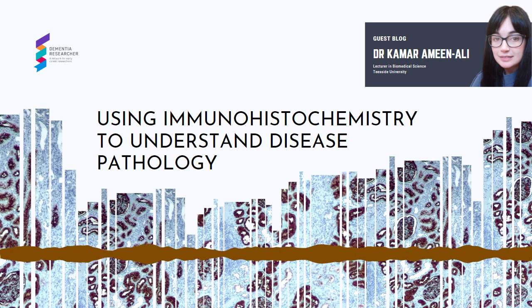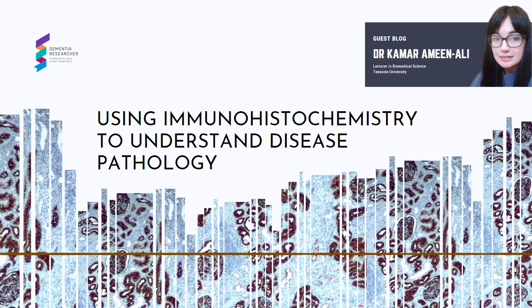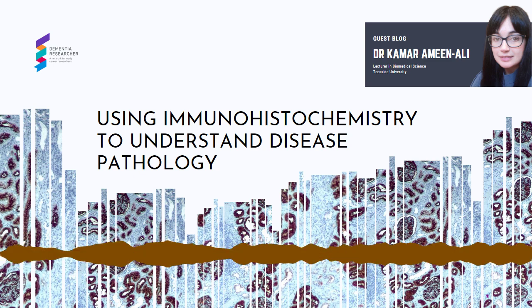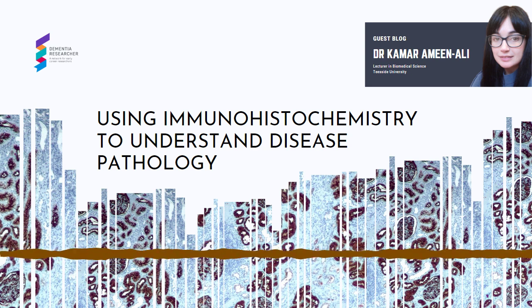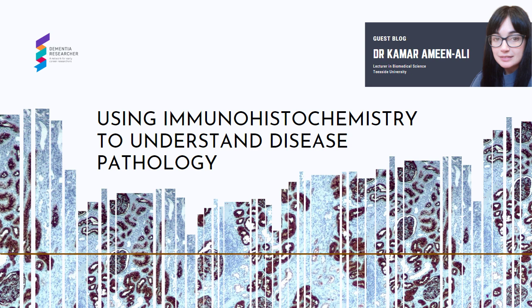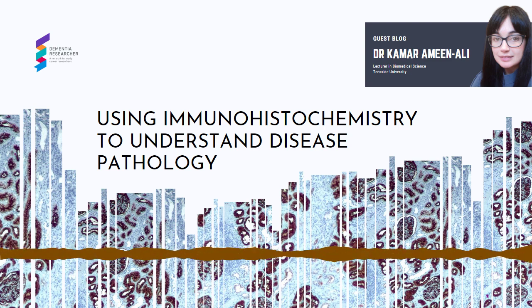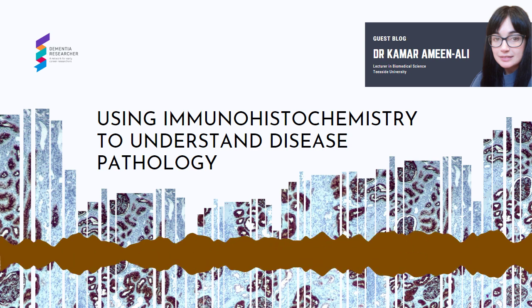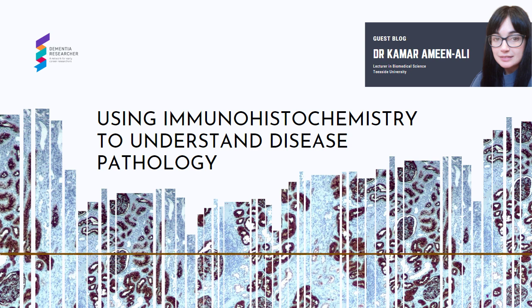But immunohistochemistry is essential for both diagnostic and experimental pathology. Neurodegenerative diseases like Alzheimer's can only be definitively diagnosed following neuropathological assessment post-mortem, where brain tissue samples can be stained for the pathology which is characteristic of the disease, such as the presence of amyloid plaques and tau tangles. Neuropathological assessment is therefore heavily reliant on immunohistochemistry to determine the presence or absence of particular disease pathologies.